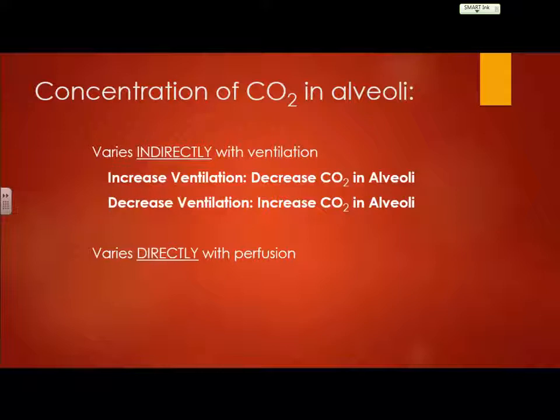All right, decreased ventilation would create an increase of CO2 in the alveoli. Think hypoventilation, right? What's happening? You're not breathing out quick enough to get it all out, and what's happening to CO2? It's just kind of hanging out, right? What about with perfusion? If you have decreased perfusion, you'd have decreased CO2 in the alveoli.